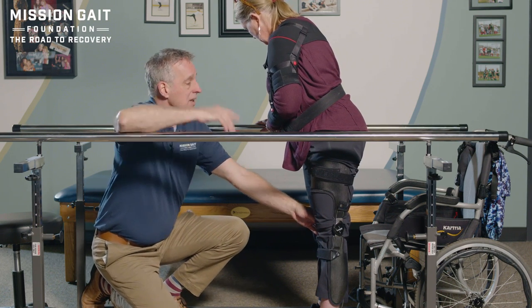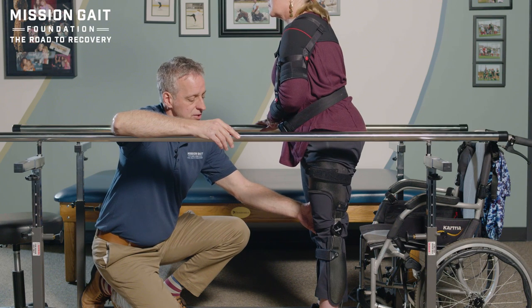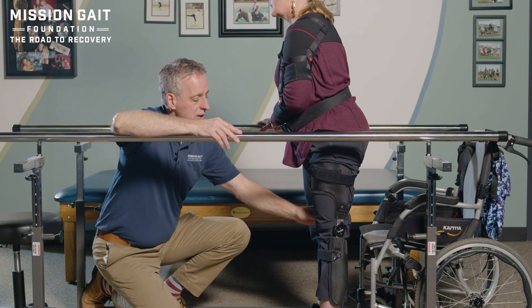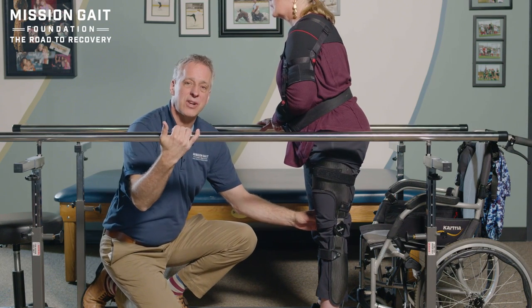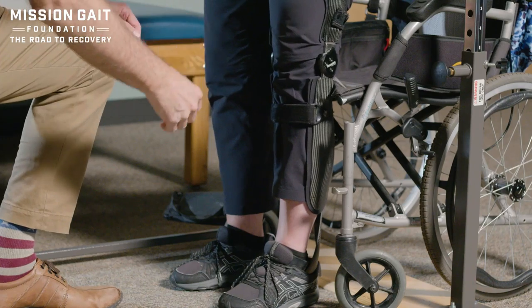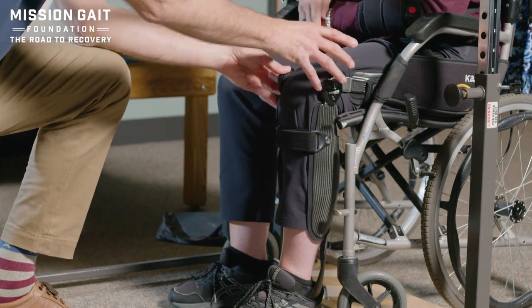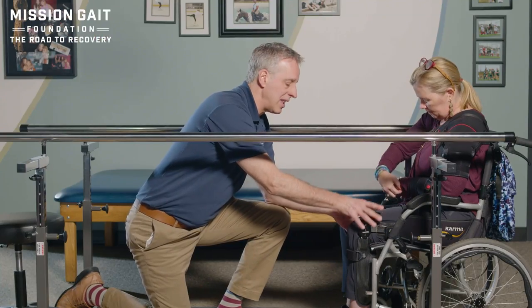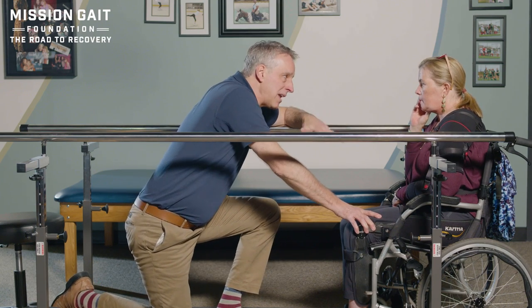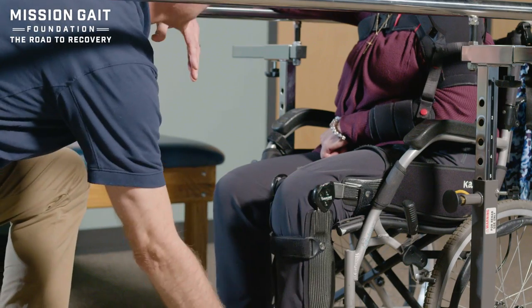The last thing is instructions in and out of the brace. If you're in the brace — very obviously — get on your feet, Eleanor, anytime you can: standing up nice and tall, checking everything out in front of you so you know where you're at and your posture is just right, thinking about weight shifting, stepping and walking. The same goes for the idea of transfers — can you use it to transfer? At this point, Eleanor, I'm going to have you step back to the chair. On her old brace, she would just kick the leg out in front of her and sit down. Now what she's going to work on is her ability to stand up tall, shift a little weight onto the orthotic, kick her hips back — see how she overcame that extension moment by not forcing it and creating more tone, but putting herself in a good position and then riding the orthotic down to the seat. If you're sitting for a few hours watching a movie, sure you can take it off, but it's beneficial early on to leave it on more than you take it off so that your body gets used to the mechanic, feels the pressure, keeps your alignment right, and keeps your foot from rolling over.